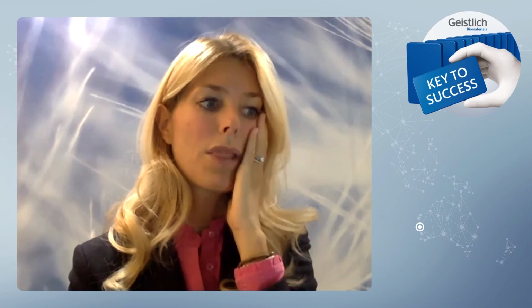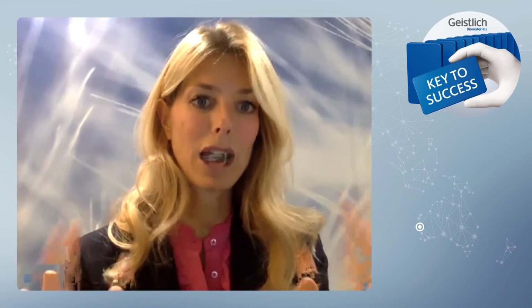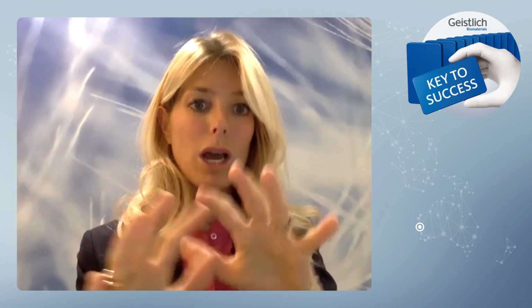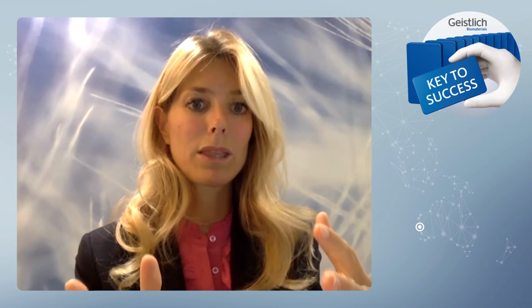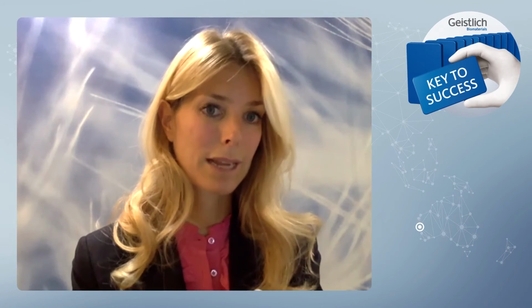Now, the point of this technique, which I find very exciting, is that whatever defect you have, you're not touching it. Because whatever anatomy it is, even if it looks like a roller coaster, goes up and down, which is nature, which is what we find, then you can cover with the membrane and use whatever the defect is giving you to augment. If you have a block, the block has to have an intimate contact with the alveolar bone.